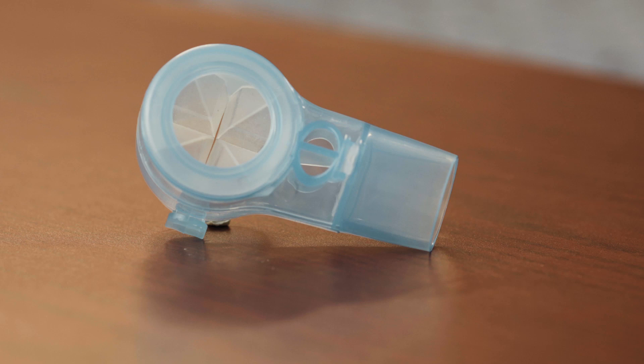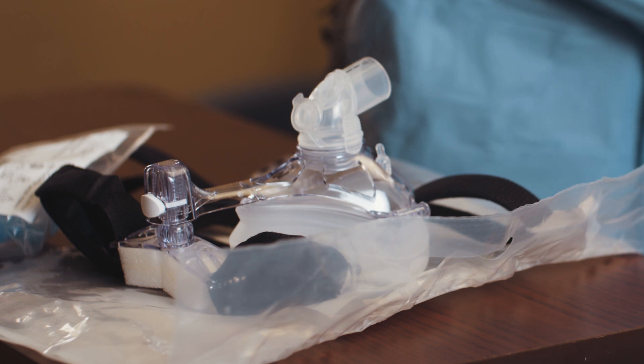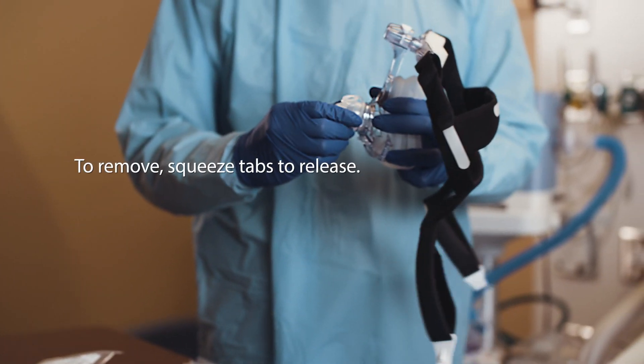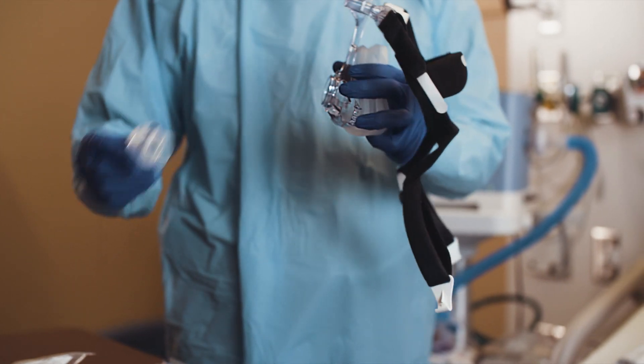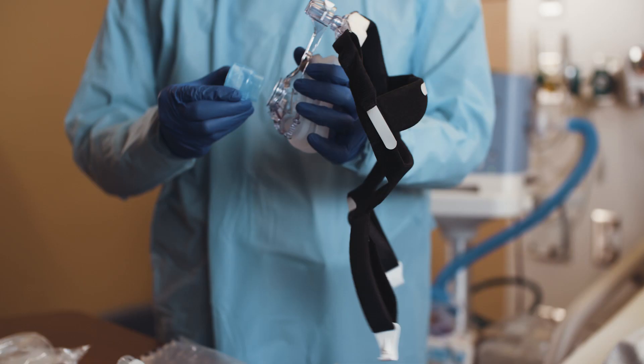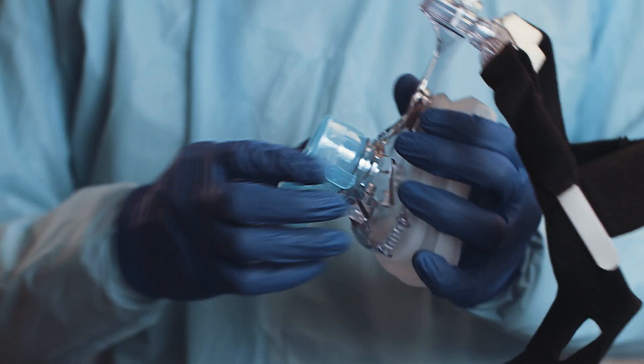The ReadyPort 541 elbow is compatible with the Philips 541 mask. Here, we're removing the existing standard elbow by squeezing the push tabs to release the elbow from the mask. Now the ReadyPort 541 elbow can be attached by squeezing the push tabs, inserting the elbow into the mask, and releasing the push tabs to secure the elbow on the mask.